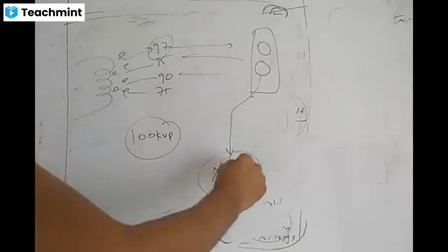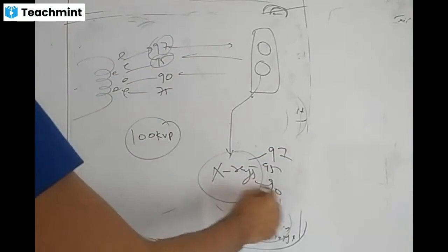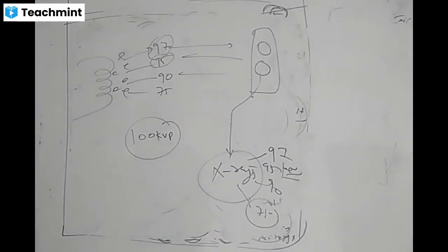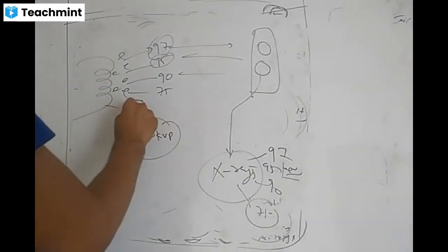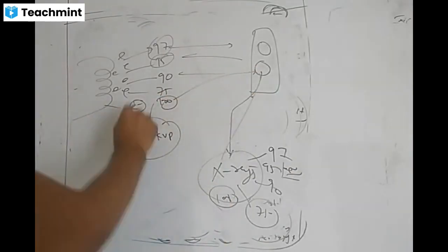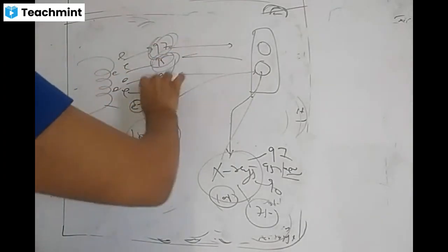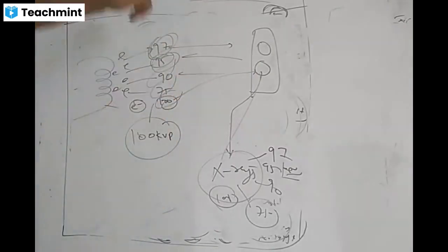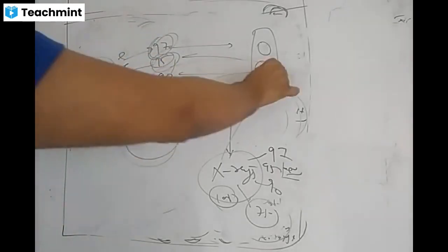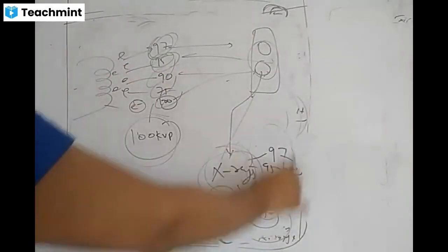Similarly, 97 will produce 97 energy X-ray, and the others will produce 95, 90, and 75 kilo electron volt energy X-ray. The one electron which gains 100 will strike and produce 100, so this is very rare, uncommon. What is common is 90, 80, 70, 60, meaning variable energies gained by the electron from the kVp. They strike, Bremsstrahlung and collisional interactions occur, and X-rays are produced, which may be of different energies.